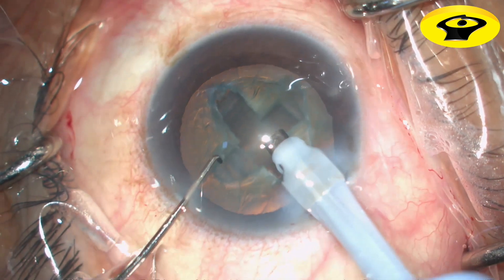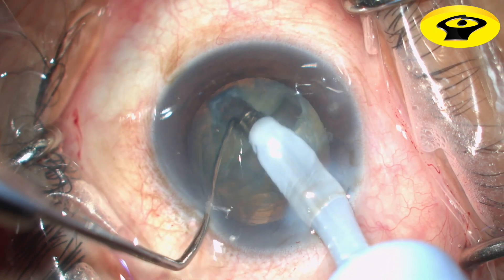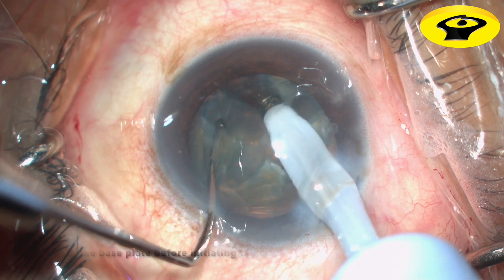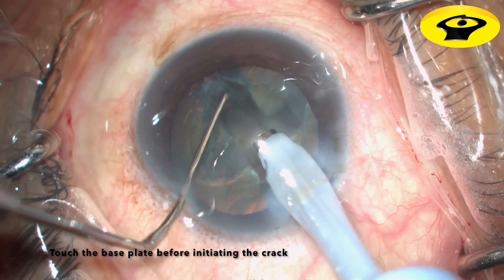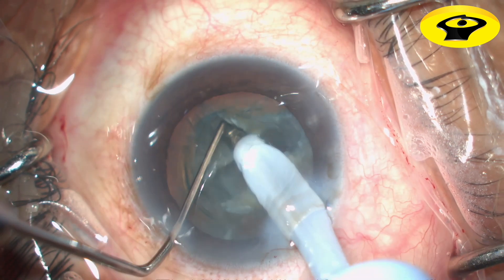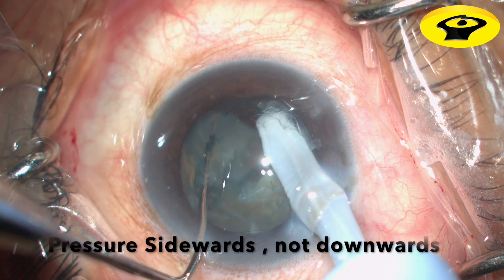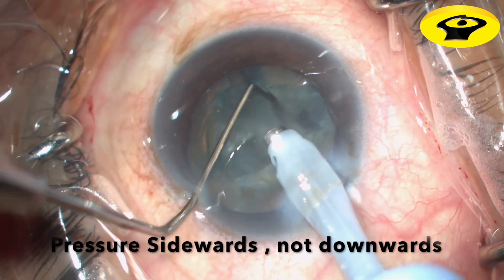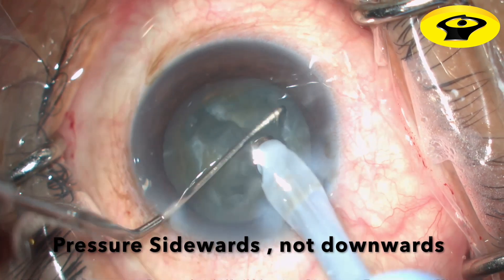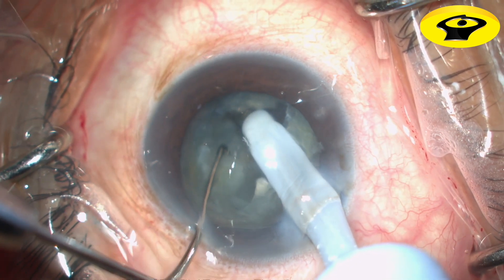Proper placement of the cracking instrument — be it the spatula or the phaco probe — at the base of the groove is critical to success. With the phaco tube in irrigation-only mode, the tip and the cracking instrument should be placed at the base of the groove. Separation of the instruments results in bidirectional force at the base of the groove and nuclear fracture.